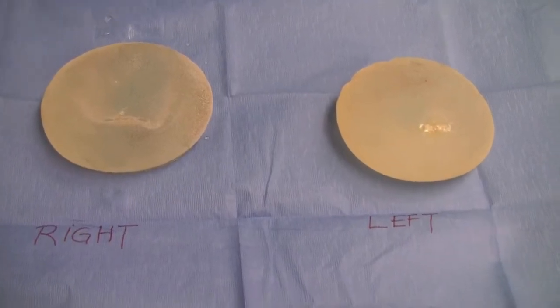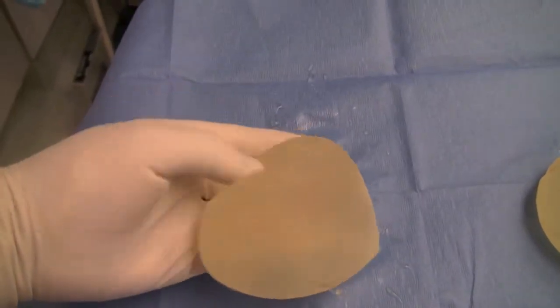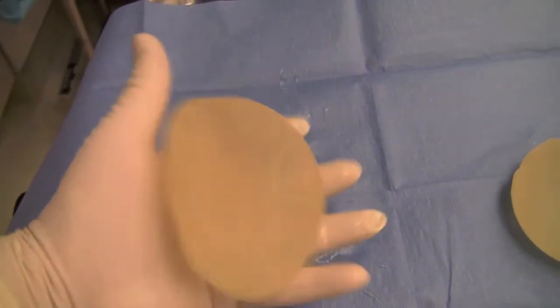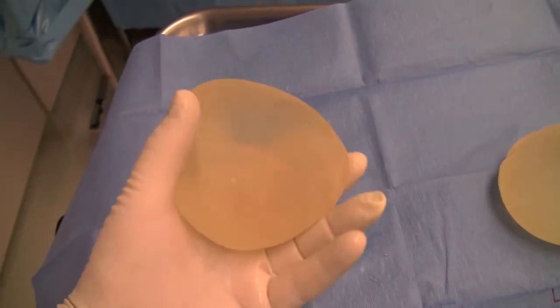There's no perfect way to inflate a saline implant. If you want the implant to be soft like this one - this is actually a leaking implant, but it illustrates the point - you want it to be nice and soft, then you run into the problem that it collapses and forms folds.